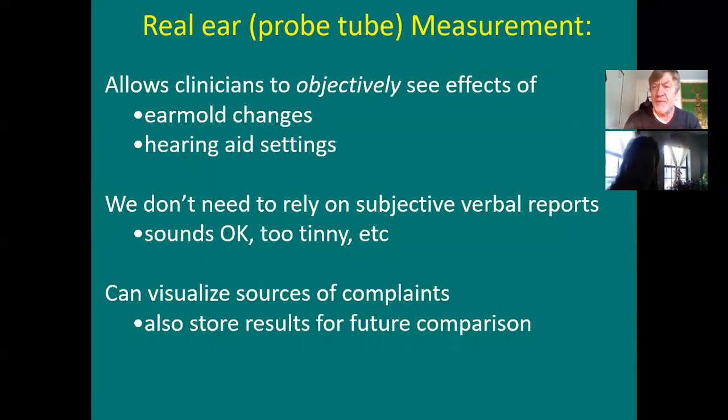See? Are you able to verify whenever you're using the proprietary software? You can too, yes. But the Real Ear system will not have the proprietary methods on it. The only system that has the proprietary fitting methods, of course, is the software. So I'll rephrase my answer to that question. No, you can't really verify, but here's what you can do.